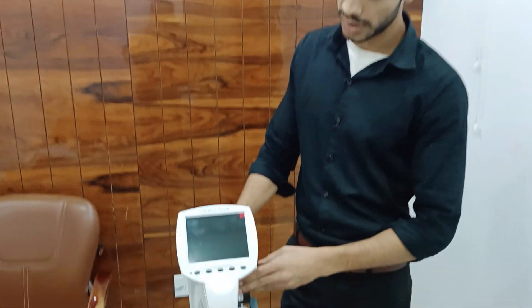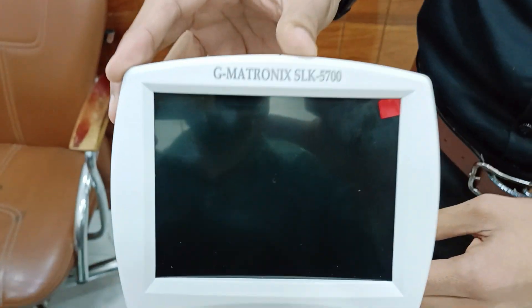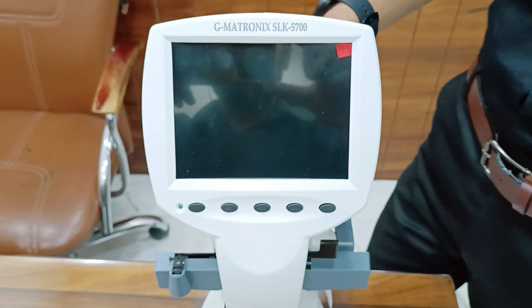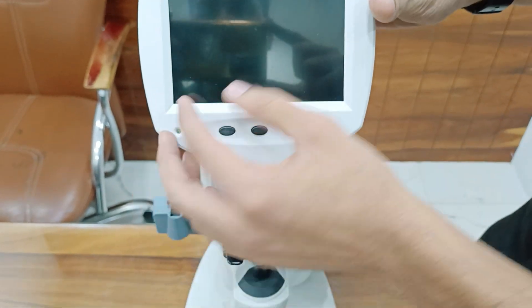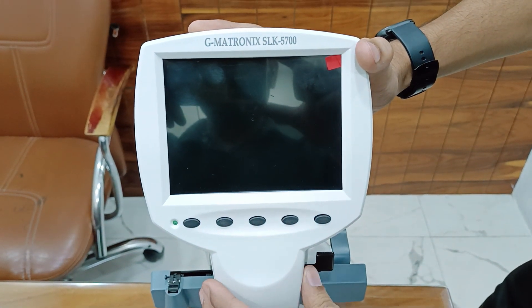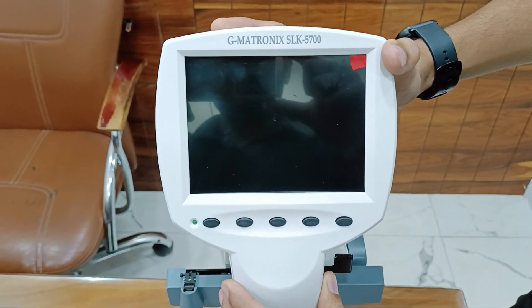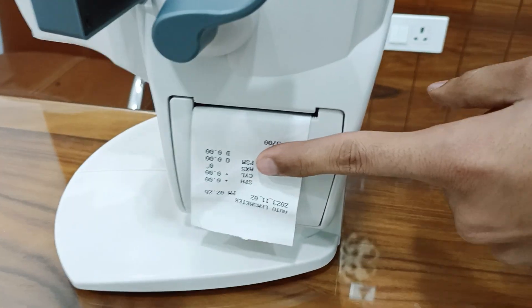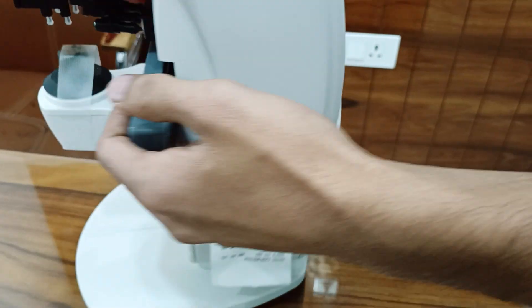Hello friends, I hope you are fine and well. Today we will talk about the most popular lensometer, GMATRONIX model SLK5700, with 95% accuracy display, 5.6 inch high resolution full graphic color LED with thermal paper inbuilt printer.